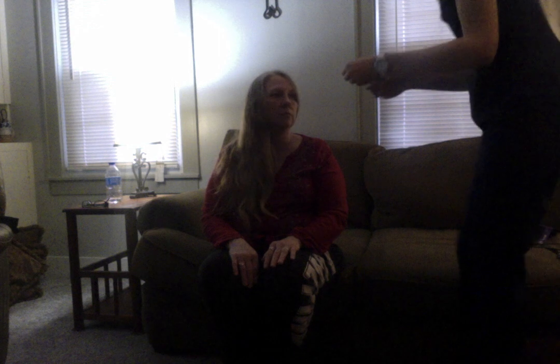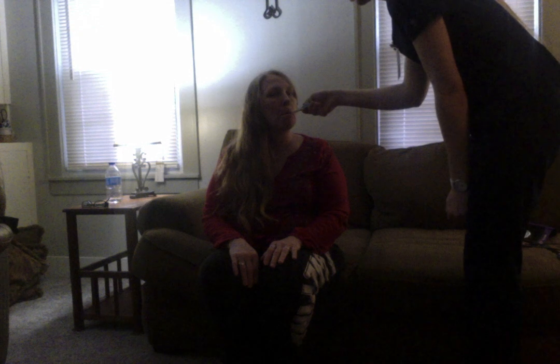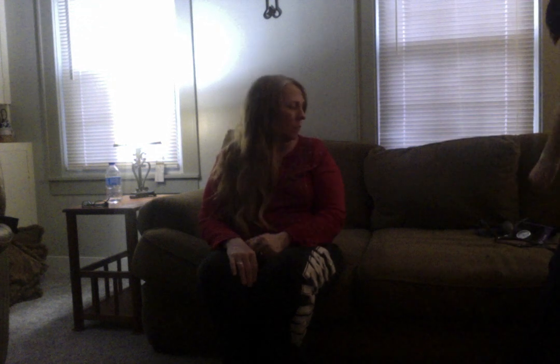So now let's go ahead and get your temperature real quick under your tongue. Alright, 97.7 is the temperature. I'm going to write that down real quick.